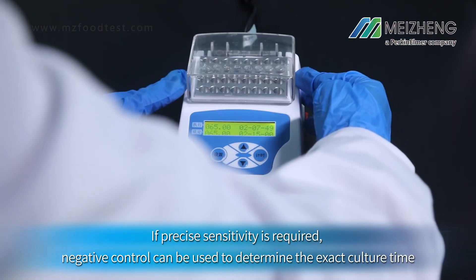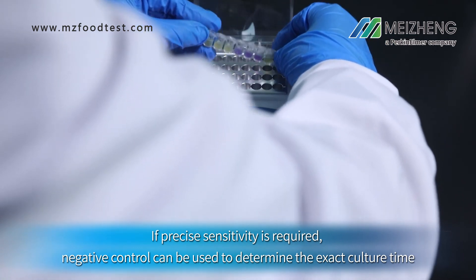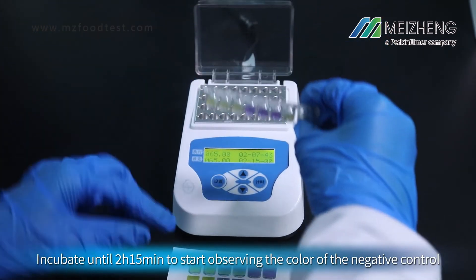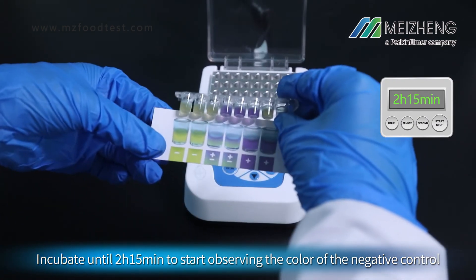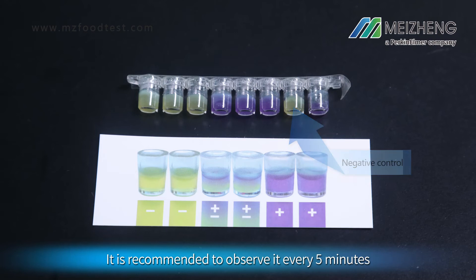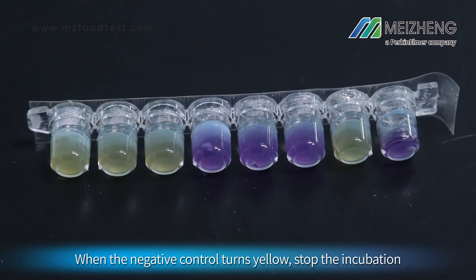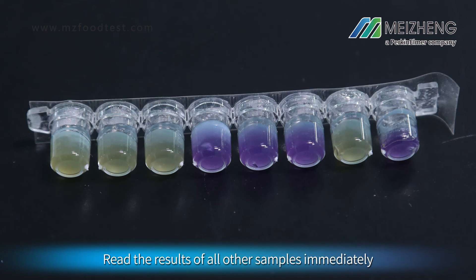If precise sensitivity is required, the negative control can be used to determine the exact culture time. Incubate until 2 hours and 15 minutes, then start observing the color of the negative control. It is recommended to observe it every 5 minutes. When the negative control turns yellow, stop the incubation and read the results of all other samples immediately.